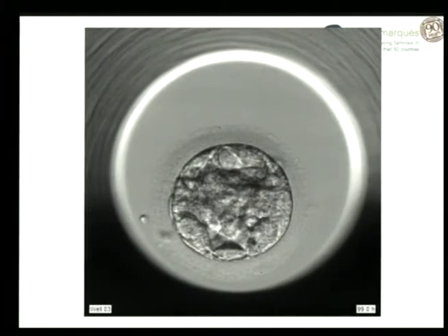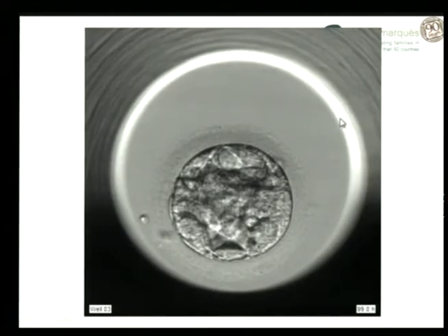And the last thing that we are now discussing is cytoplasmic strings. The cytoplasmic strings are the strings that blastocysts have between the inner cell mass and trophectoderm cells. You will see it here. It's not working, but the image is very clear when you see a blastocyst, because in order to keep the inner cell mass completely isolated from the trophectoderm, you have these connections from the inner cell mass to the trophectoderm, which some authors say are a prognosis that the embryo cannot implant.